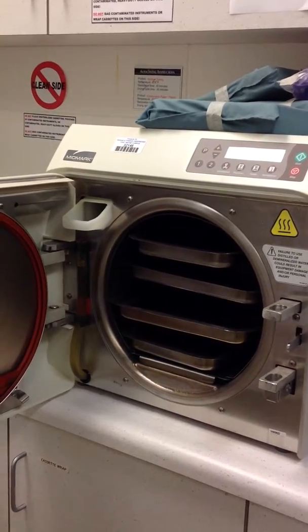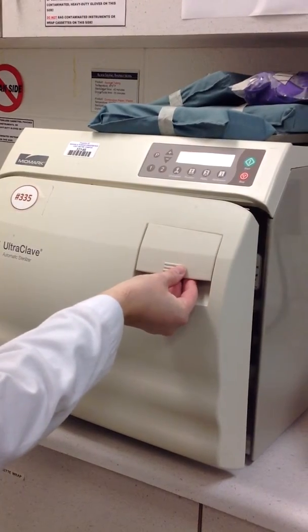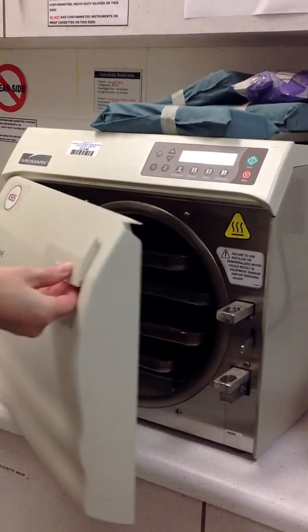Okay, so how you use the mid mark — the first thing you're going to do is lift up on the latch to open the door if it's locked.